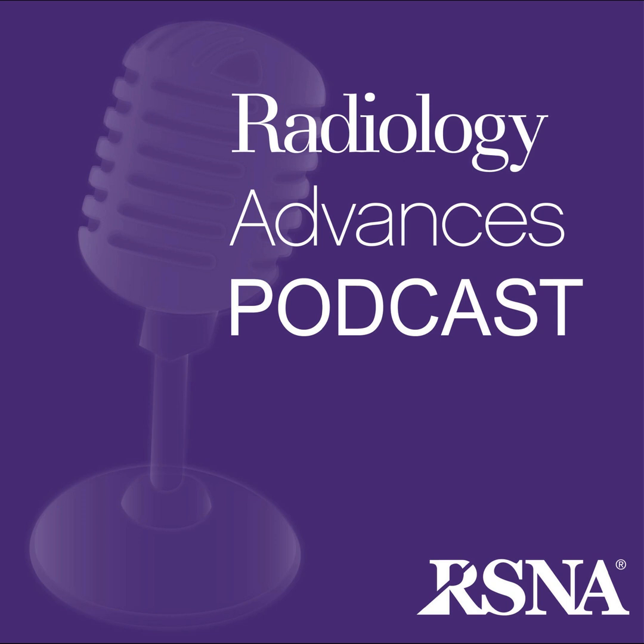That's the clever part. They're leveraging the inherent capabilities of dual energy CT. Specifically, the scanner type they used was a dual-layer dual energy CT, which has detector layers that simultaneously register low-energy and high-energy photons from a single X-ray source. From this simultaneously acquired raw data, you can do more than just create standard-looking images. And the algorithms they focused on were these electron density and Z effective maps, ED and ZF. Exactly. Let's unpack those a bit.